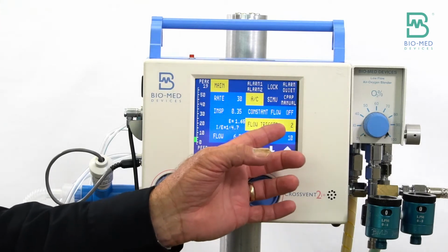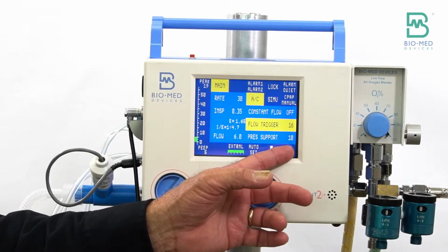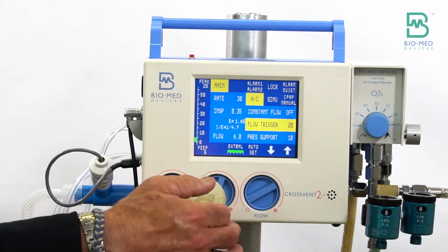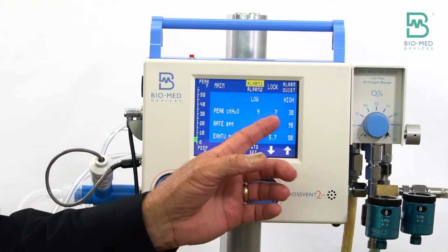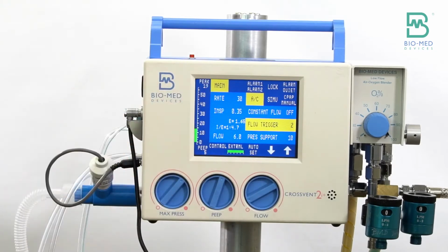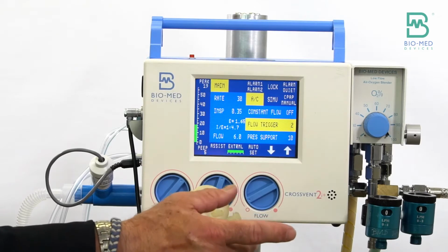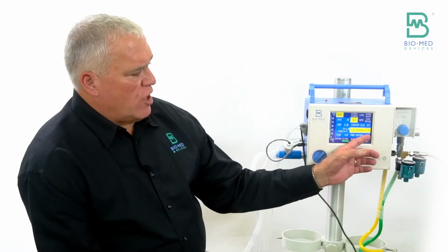So flow triggering can be adjusted from 1 up to 20. 20 is not so sensitive. It takes a lot more effort for the patient to trigger. Where this is set is really dependent on how much leak you have. If you don't have any leak, you can set this down to say 1, 2, or 3. You typically want it as easy as possible for the patient to trigger, but not auto cycle.